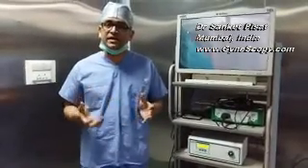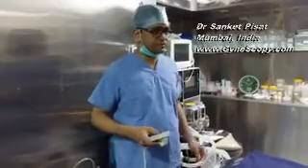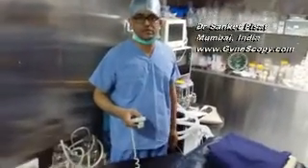The fourth important thing to see after entering the OT, if you are planning a major surgery, is whether adequate blood has been reserved or not. So with these basic preoperative precautions, we proceed to the next step. When you enter the OT and you are going to start surgery, is the rest of the OT prepared for an endoscopic surgery or not?